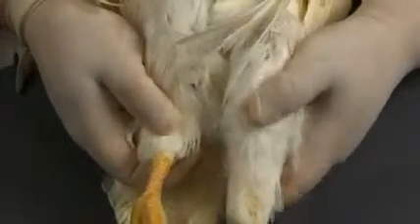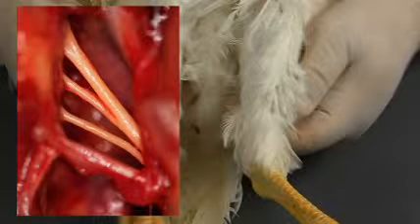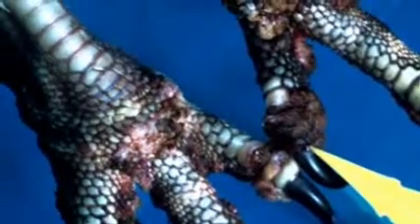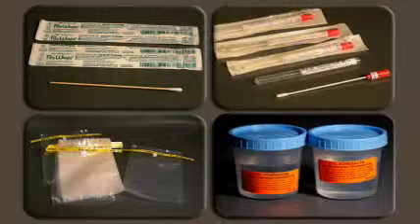Any muscle atrophy observed during the external exam will require a close inspection of the corresponding nerves during the internal exam. Visually inspect the skin on the limbs, which is covered by scales that are normally dry, flat, and slightly overlapping. Some parasites live beneath the scales of the legs. Some infectious diseases can cause keratinous outgrowths from this skin. If these lesions are seen, they should be collected for laboratory testing and histopathology.